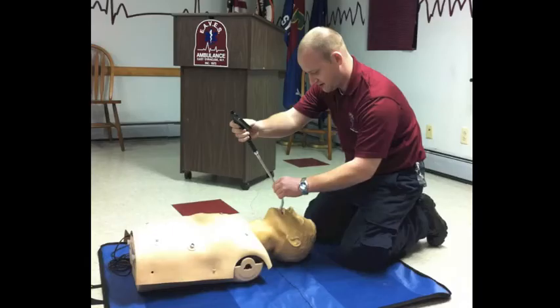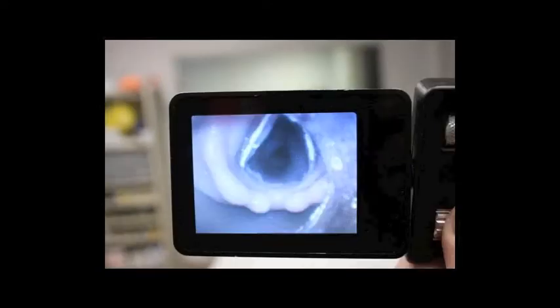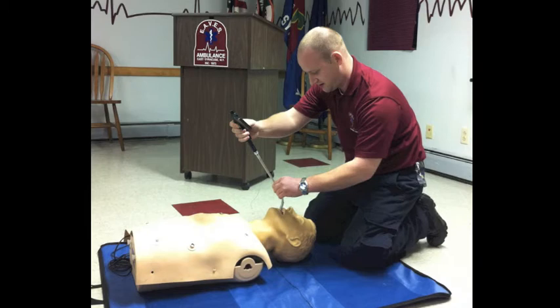It is important to follow the airway as you go in. First you will see the uvula and tongue, then the epiglottis. You will proceed under the epiglottis. You will first see the arytenoid cartilage, and then clearly will identify the cords and the trachea. Then proceed through the cords with the device. Once through the cords, slide the endotracheal tube off the stylet through the cords and inflate the balloon.